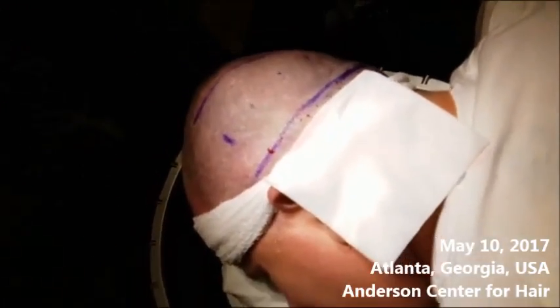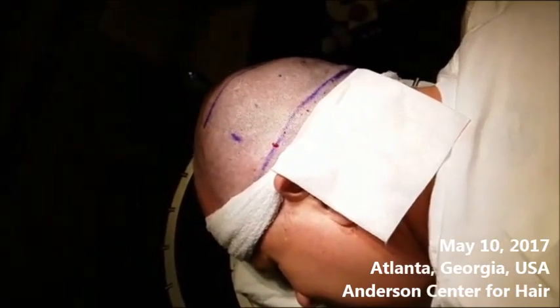How are you doing, Charles? All right. So what we're going to do today is, from this little area here, we're going to extract some follicles for transplantation into the areas of need. And we're going to watch that live right now.